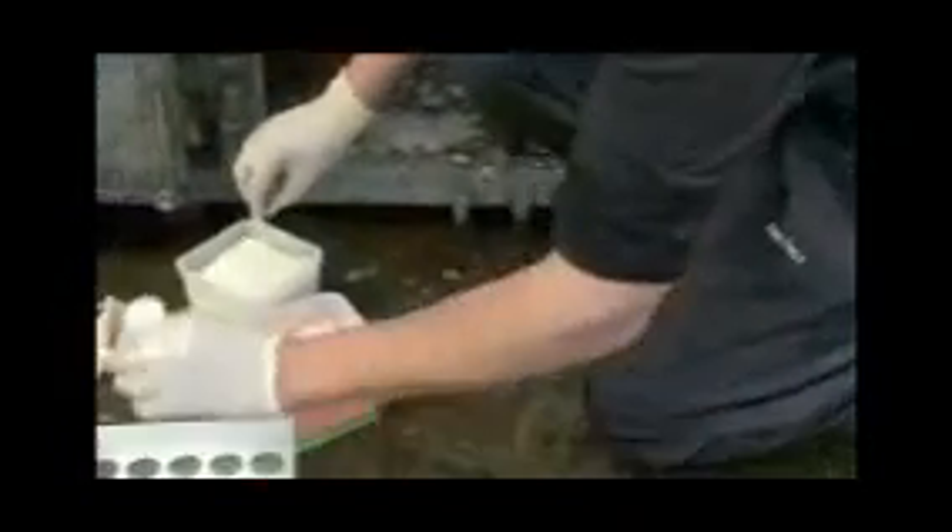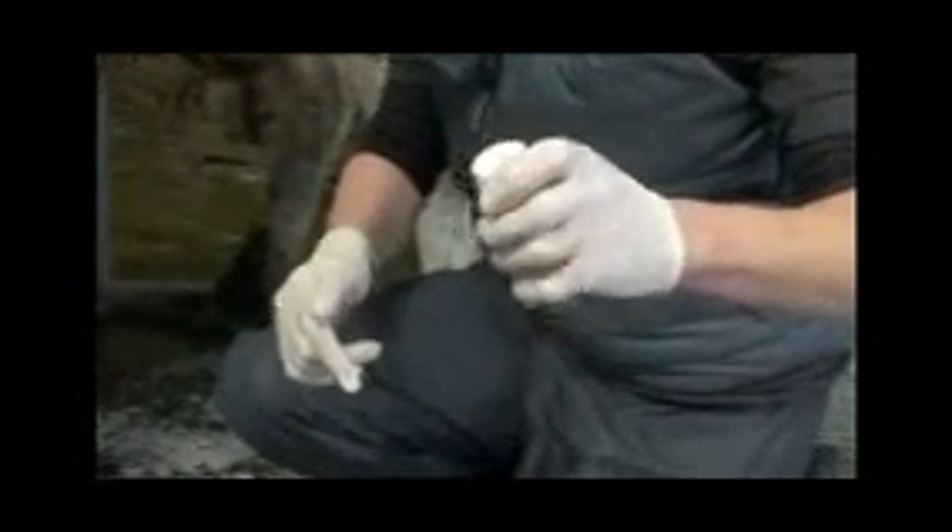We've cleaned off the teat. The next thing to do is to clean off the gloves that we're wearing, making sure that we've got no remnants of anything left on us — and that's with some surgical spirit. Get our sample pot ready that we've already loosened the lid on, to make sure we're not going to get too much debris trapped in it. We're going to collect the sample by tipping the pot on one side, which means the milk can go straight in and we don't need to worry about getting any bits of dust or straw entering the tub.